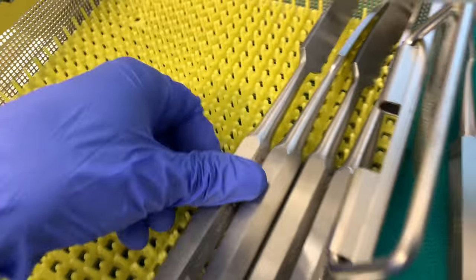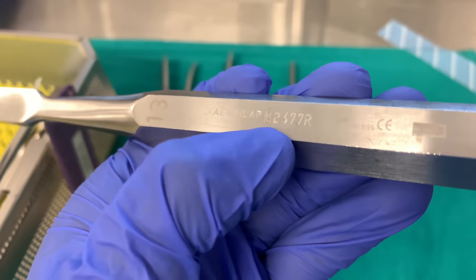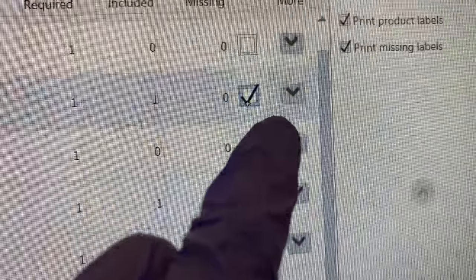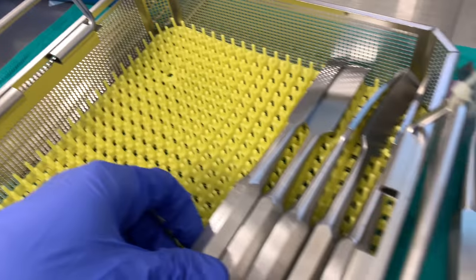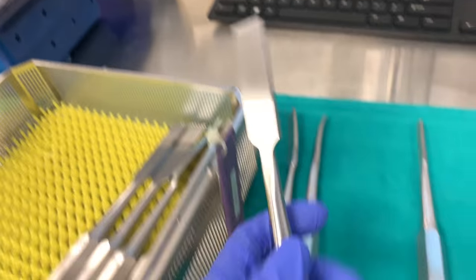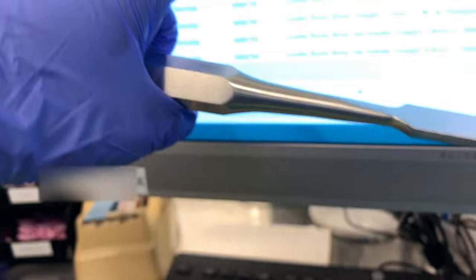Looks clean, no stains. This one's 689R and it looks clean too. Osteotomes are pretty sharp by the way — you gotta be careful when you're handling them. This one is 678R, let's see — 678R right there.